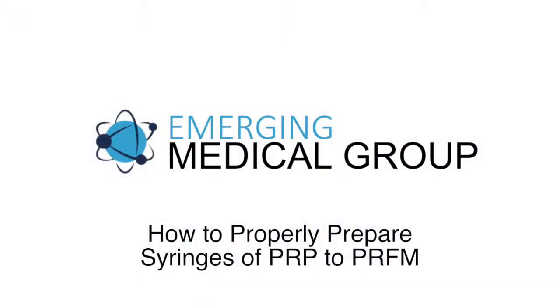This video will demonstrate how to properly prepare syringes of platelet-rich plasma to be used in conjunction with the Regenerative Medical Bio Incubator to produce platelet-rich fibrin matrix bio filler.